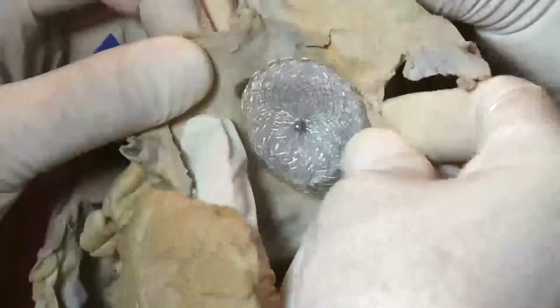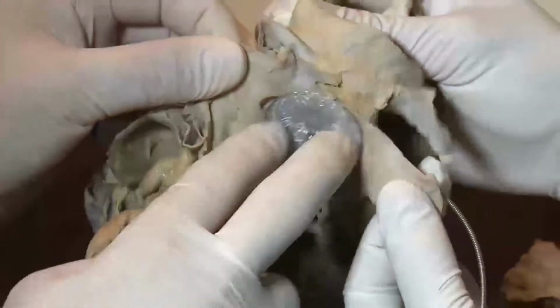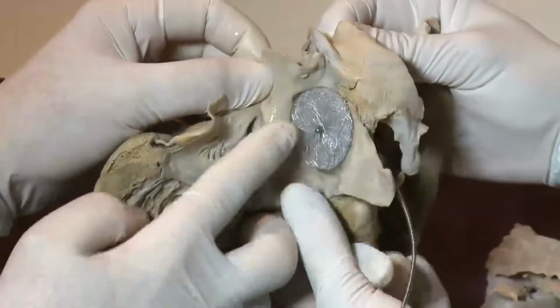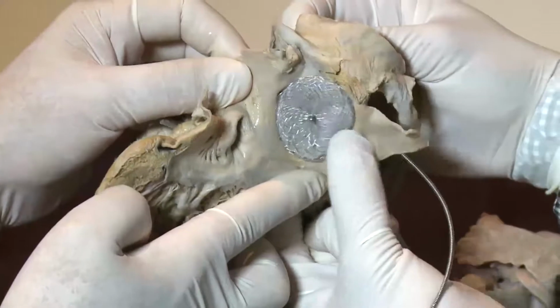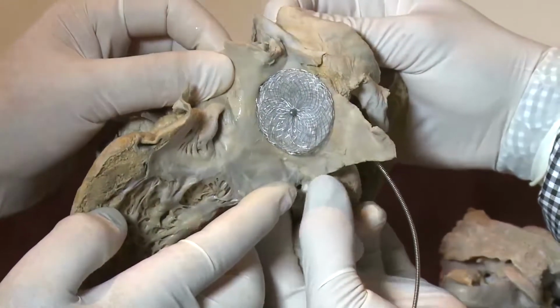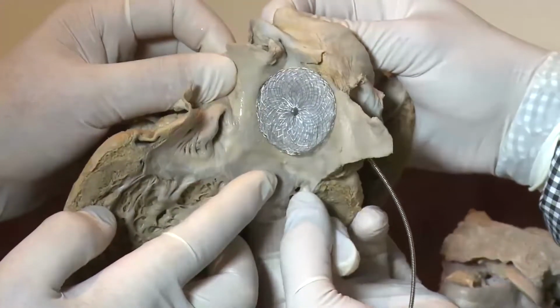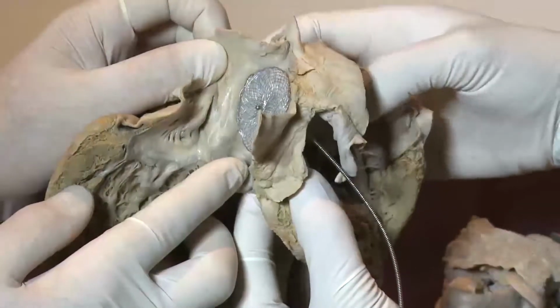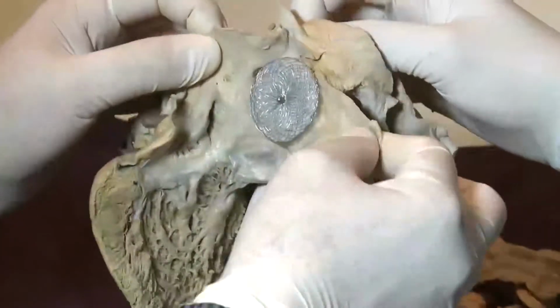From the LA side, sometimes in a big ASD, if the mitral rim is short, this device may touch the mitral valve leaflet and make a hole in the valve leaflet. In Sejong General Hospital, we experienced one case of mitral valve erosion, surgically corrected 4 years later. So we should check all these things.